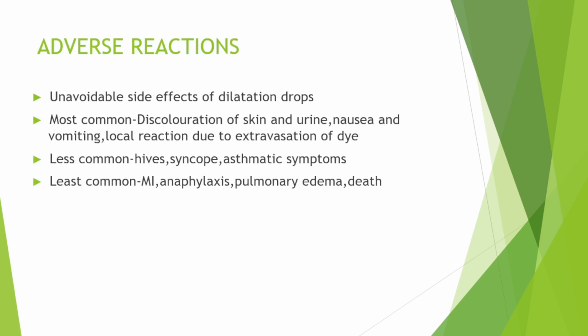Coming to the adverse reactions, due to the dilatation drops, side effects can be there. Other than that, the IV procedure-related side effects include the most common ones: discoloration of skin and urine, nausea and vomiting, which is the most common side effect, and local reaction due to extravasation of the dye. Thrombophlebitis and tissue necrosis can occur. The less common ones are syncope, asthmatic symptoms, and hives. Least common are MI, anaphylaxis, pulmonary edema, and death, which are very rare.